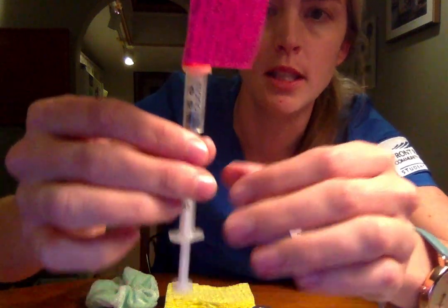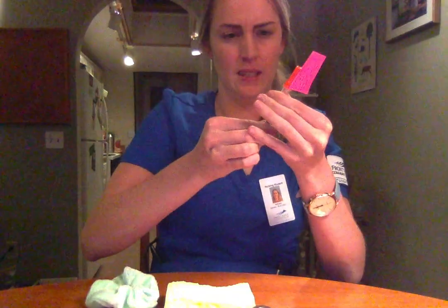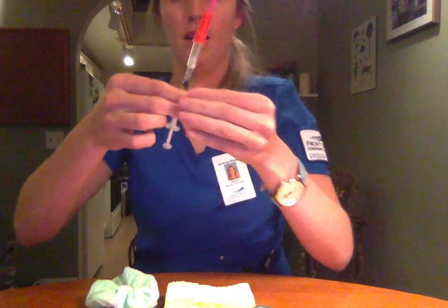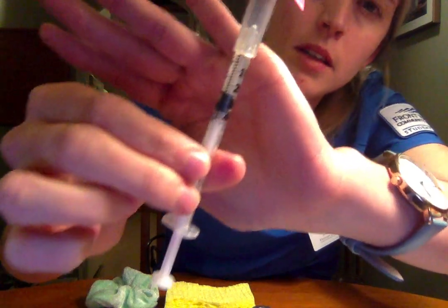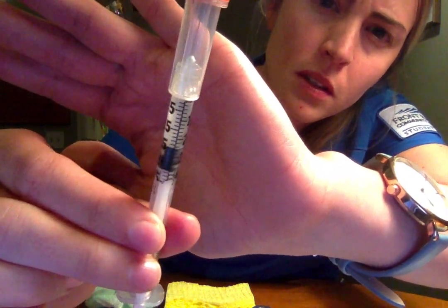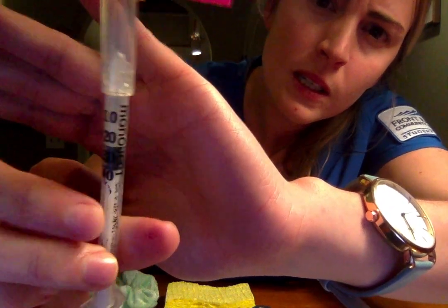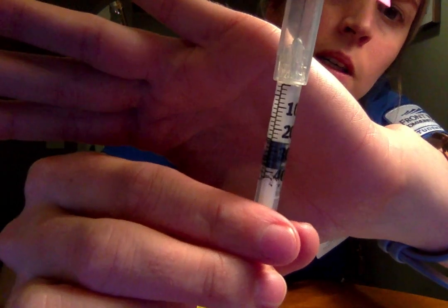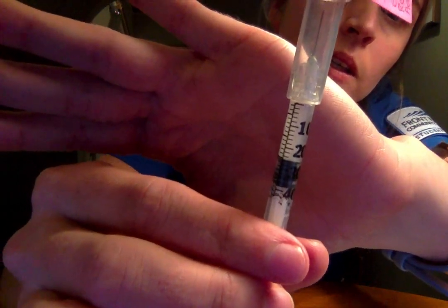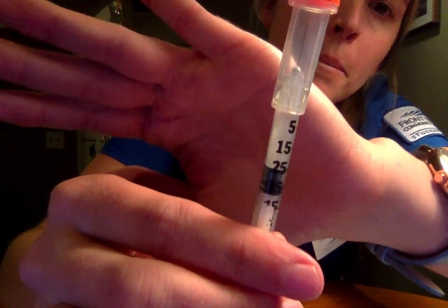I'm going to engage the safety because it's easier to see. Okay, alright, so I'll show you that I have the correct amount. Okay, and no bubbles.